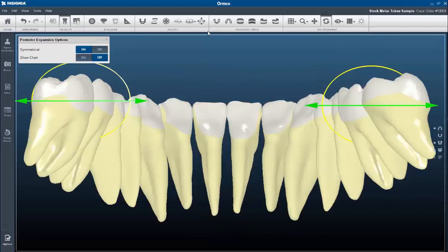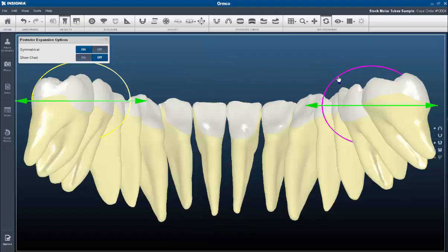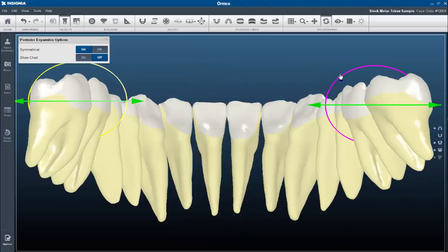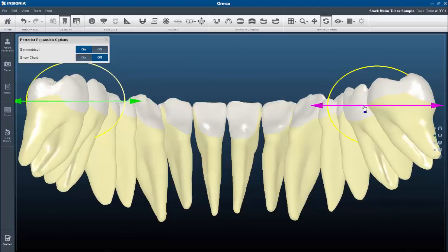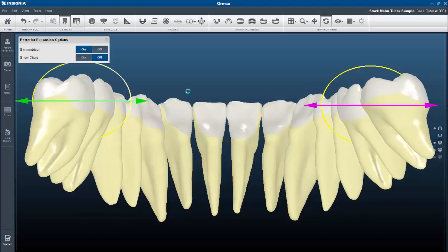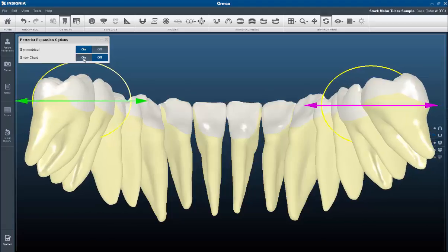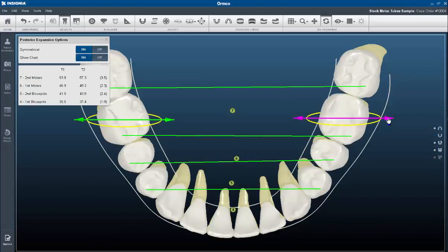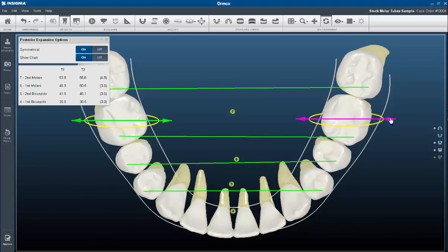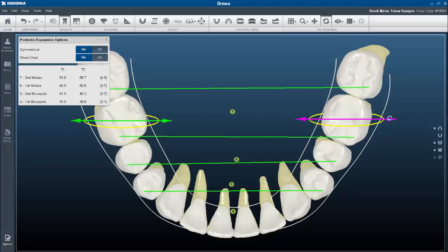Posterior expansion gives you the ability to either expand or upright the posterior segments. When expanding, you can switch on the chart so you are able to see the mandibular trough and the amount of expansion. With every change, the case will automatically be reworked.